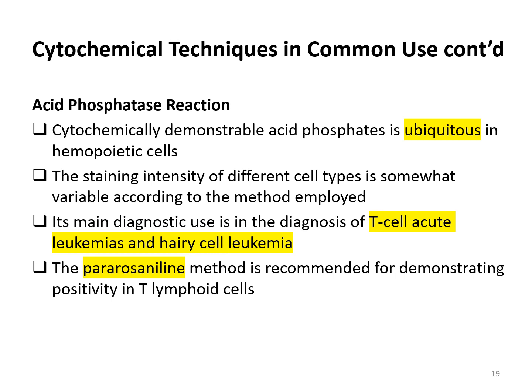This is used for the identification of acute leukemias and hairy cell leukemia. So far this is the only situation that we mentioned of a condition affecting the lymphocytic series.